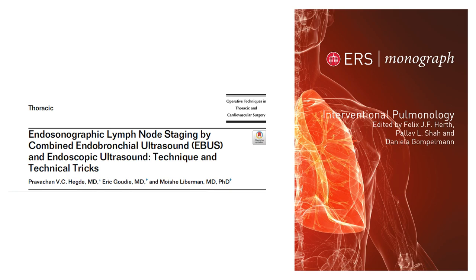And I would also have the thoracic surgeons on board as well, in case you have a complication, which rarely happens, less than 1%. And if you ever have a perforation that needs a stent or whatnot, having a good rapport with the thoracic and GI colleagues may help in those situations.